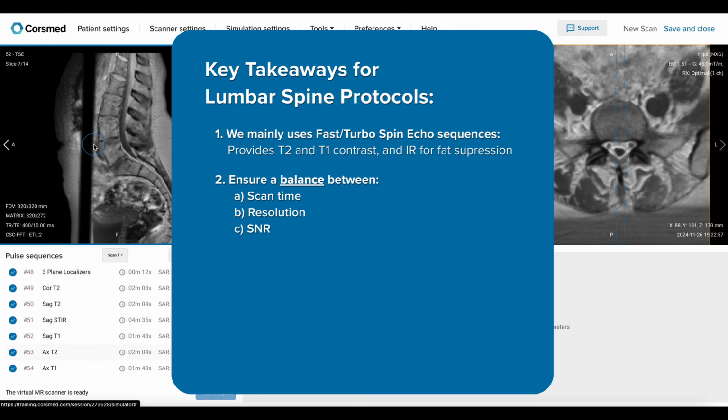Second, when you run your sequences, you want to have a balance between scan time, resolution, and signal-to-noise ratio. However, you may want to slightly prioritize scan time, because the lumbar spine is such a commonly requested protocol in MRI practice. By optimizing slightly for scan time, you will be better able to complete all the incoming requests in time.